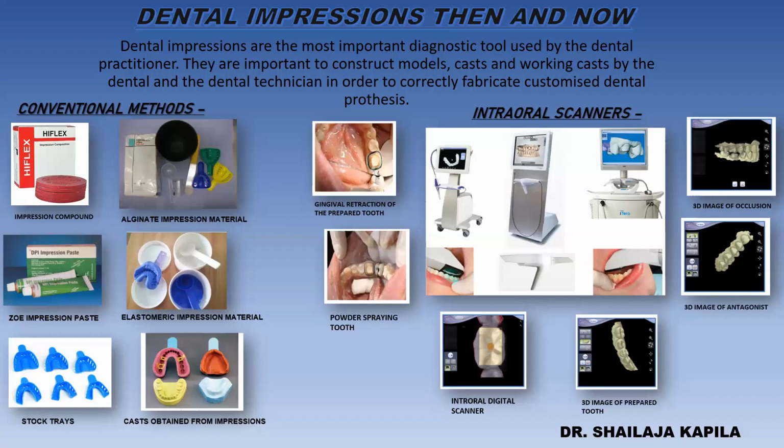Compared to a conventional impression, intraoral digital scanning can save time and steps for dentists and technicians. Steps eliminated at the dental office include tray selection, material dispensing, material setting, material disinfection, and impression packaging and shipping. Steps eliminated at the lab include plaster pouring, die cutting, trimming, articulation, and extraoral scanning. The intraoral digital impression technique has been used in prosthodontics to aid the CAD/CAM process.